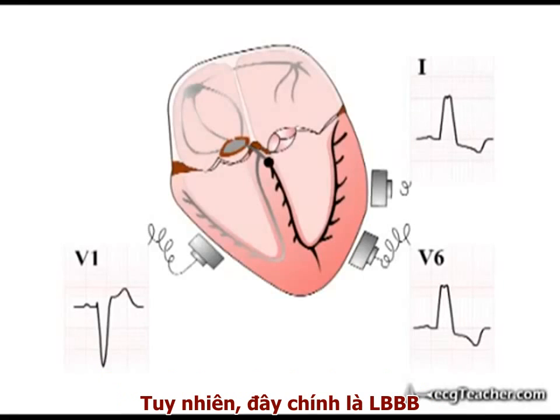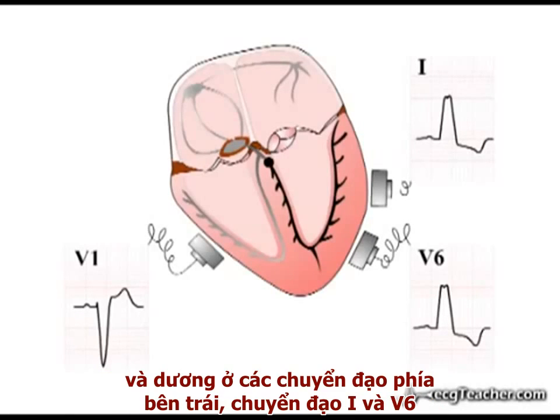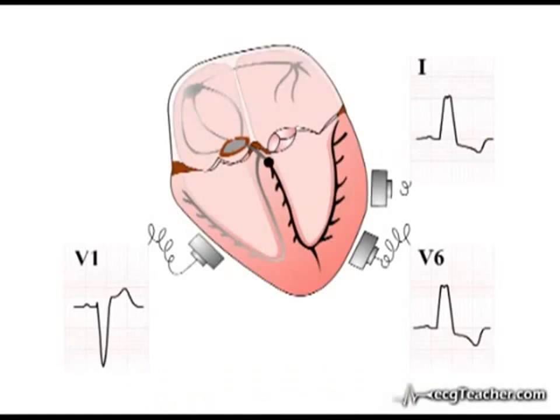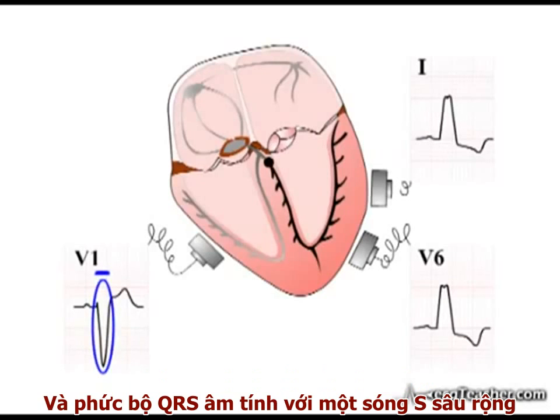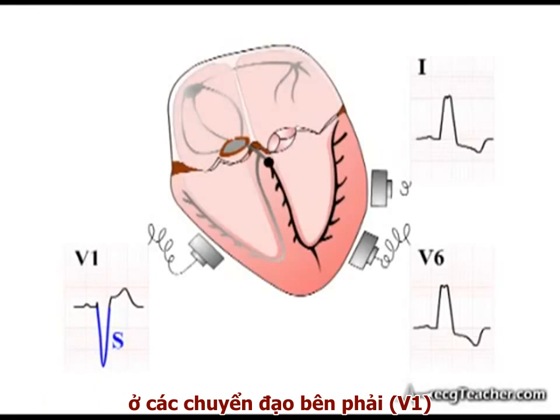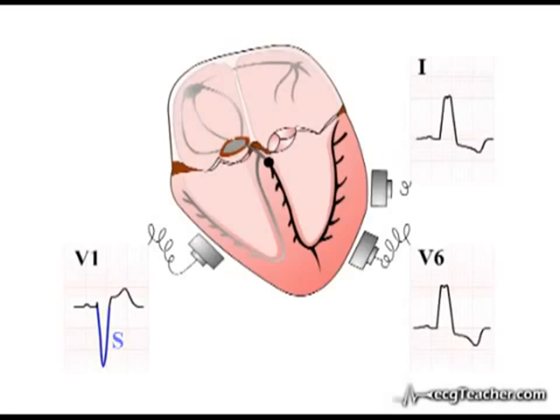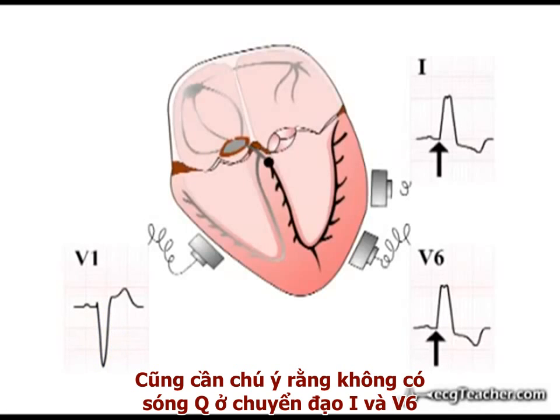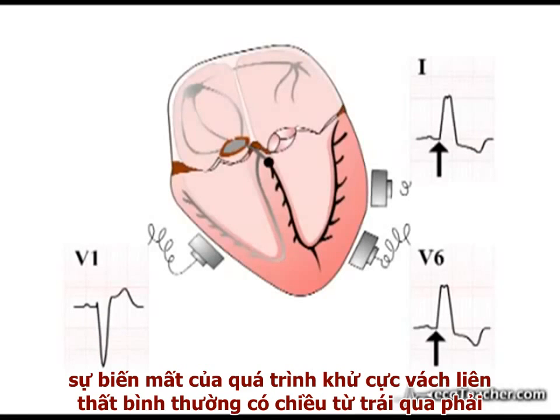However, this is left bundle branch block, as the QRS complex is broad and predominantly positive in the left-sided leads, leads 1 and V6. An overall negative QRS complex with a deep, wide S wave in the right-sided chest lead V1 is also consistent with the diagnosis. Note also there are no Q waves in leads 1 and V6, which is consistent with loss of the normal early left-to-right depolarisation of the septum.